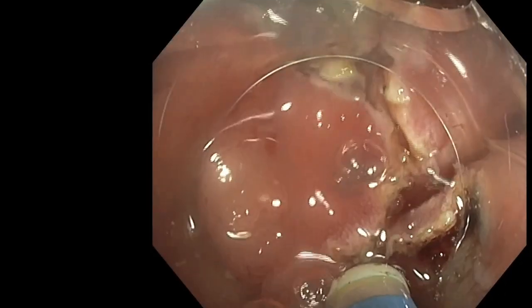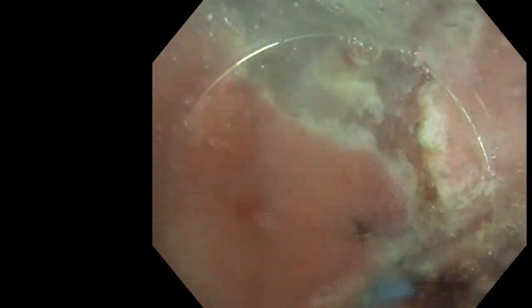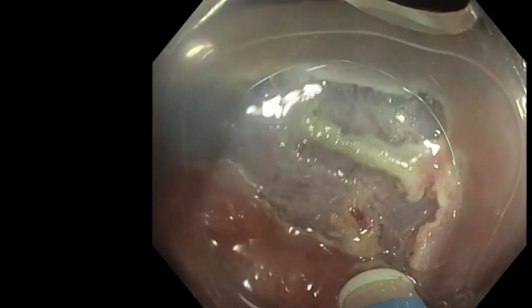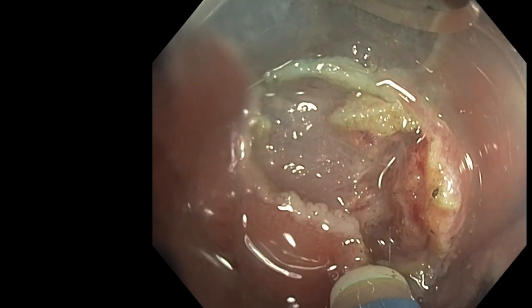If you push it, you have a risk of damage to the muscle, because usually the submucosa is very thin inside the diverticula. So here, if you go quickly and strongly and deeply with your knife, the risk of damaging the muscle is probably not low. So once again, I pull.